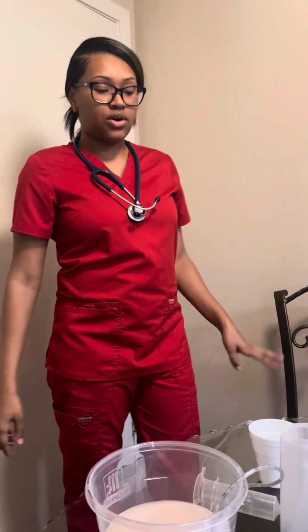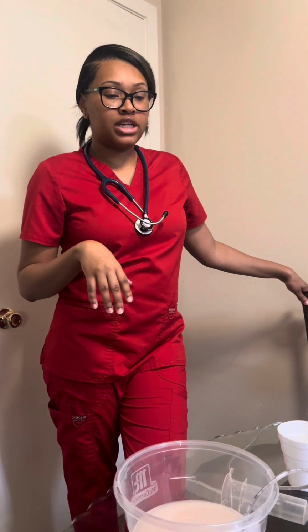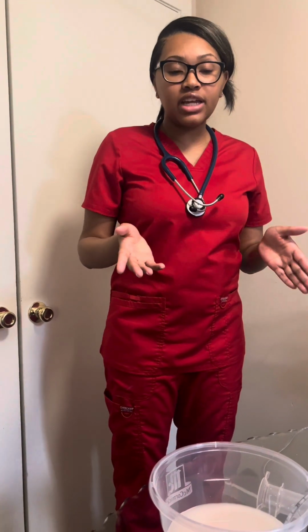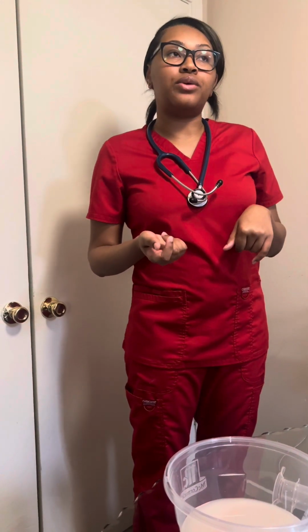Okay, so after I get done with that, I would leave the patient in semi-Fowler's. I will also determine whether I should continue the feeding. If not, I'll have to come back in an hour to 2 hours.